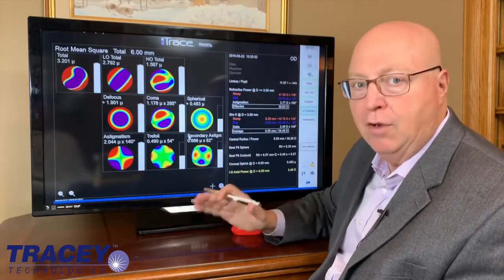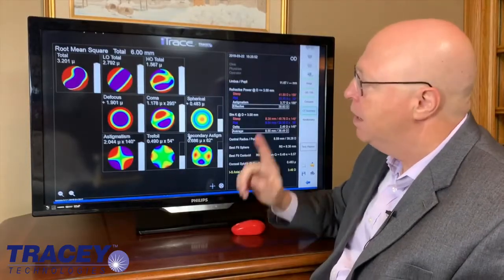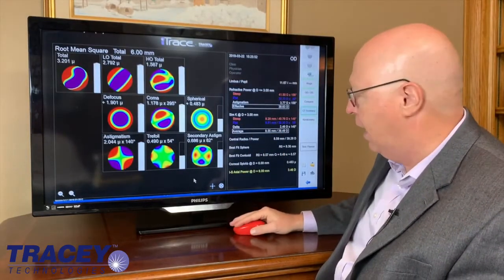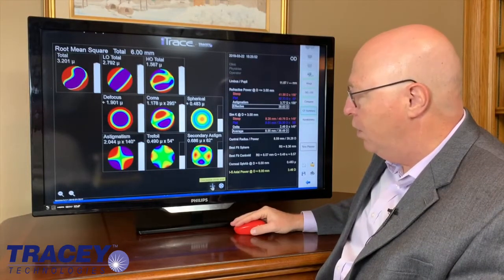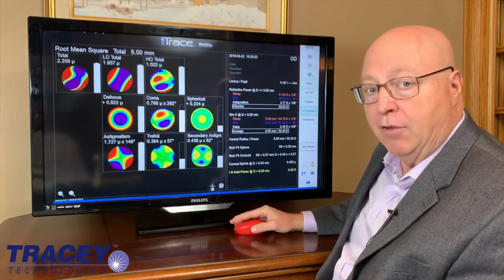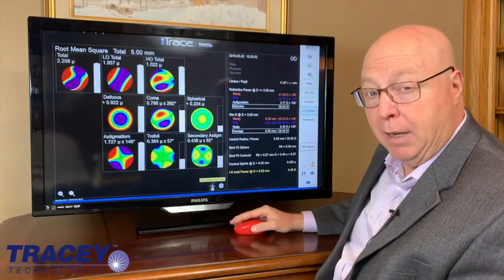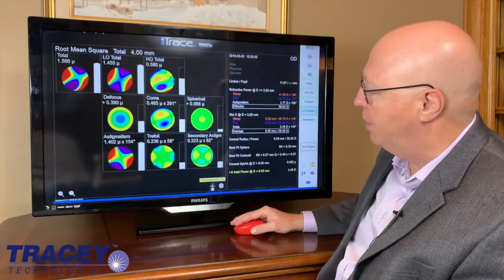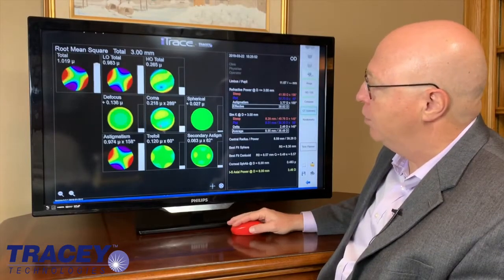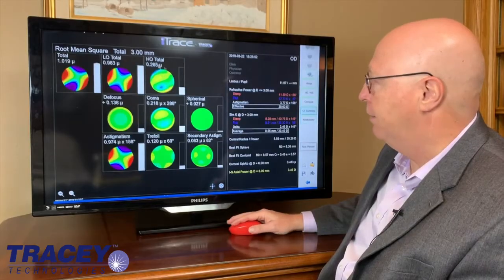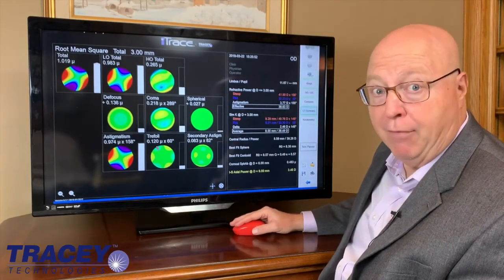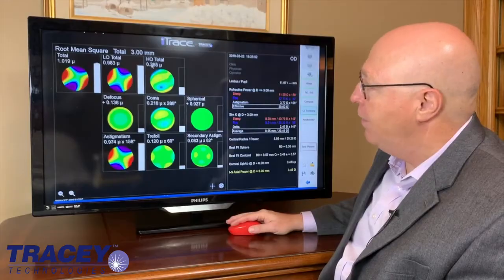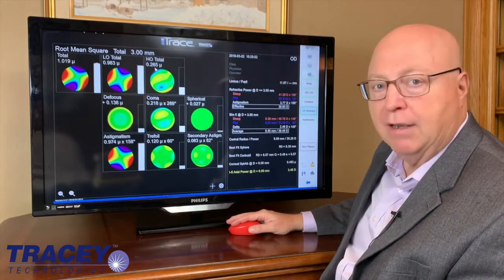What I'd like to do is show you how the eye trace teaches you and makes you think. When you decrease the zone size because she has a small pupil — about three millimeters — watch as that number goes down. When you get to three millimeters, it's not ideal by far, but it's a whole lot better. Now the aberrations total are 0.265.